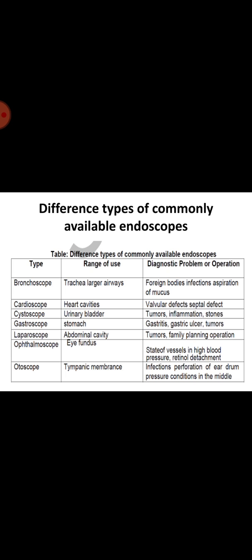The third category is treatment. Endoscopy can be used to treat the illness directly. For instance, endoscopy can be used to seal bleeding vessels using heat, or remove a polyp. Sometimes endoscopy will be combined with another procedure such as an ultrasound scan, and it can be used to place the ultrasound probe close to organs that can be difficult to image, such as the pancreas.